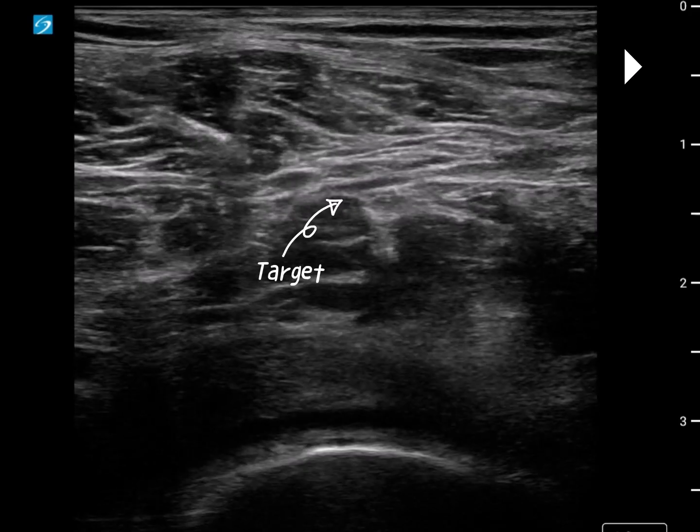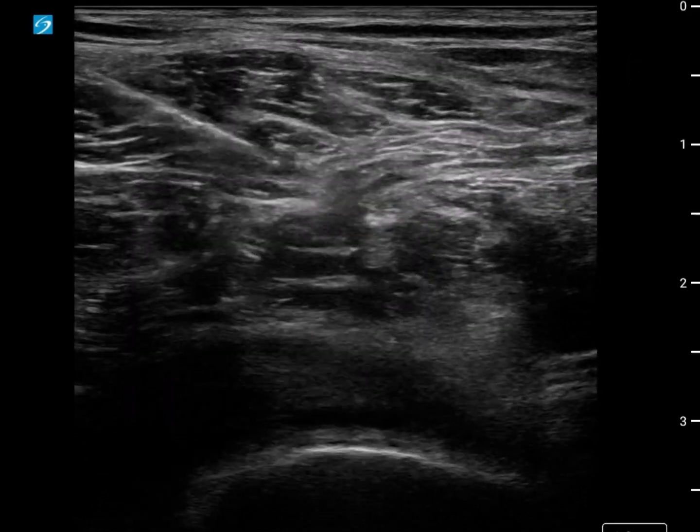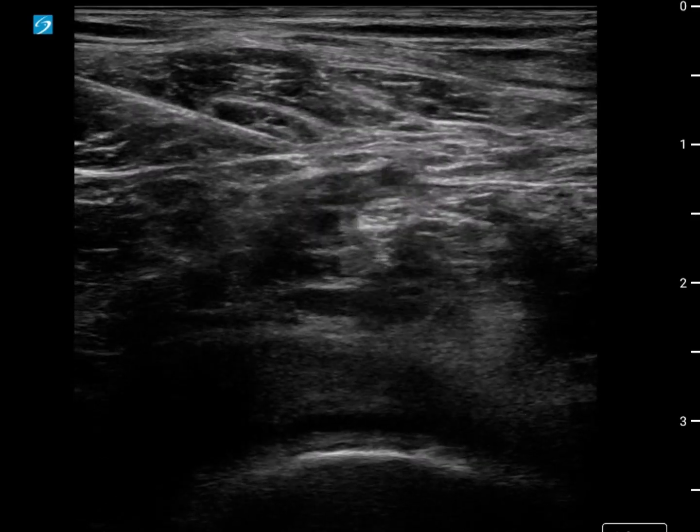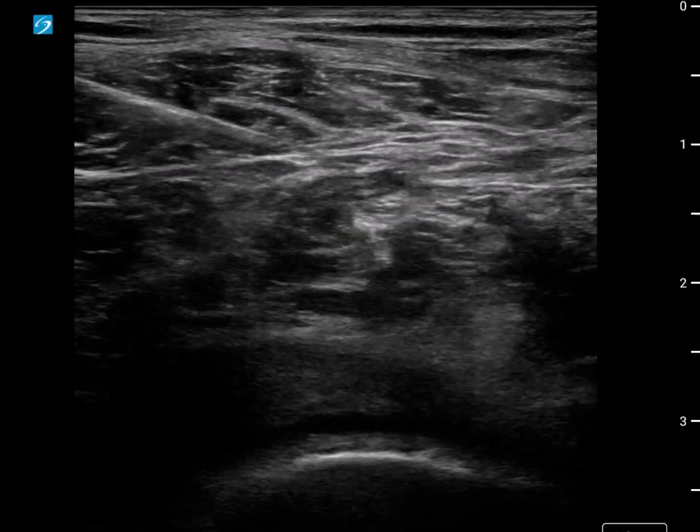As we continue with the video, we're going to get some little pops - it'll pop. One more little release there, and we're going to start with our test injection. We'll pause. That could be better. We've got a little bit of spread laterally, a little bit spread medially, but it doesn't look very good. So what we're going to do next is pause our needle, flick around with the ultrasound, and see what the outcome of that injection was.